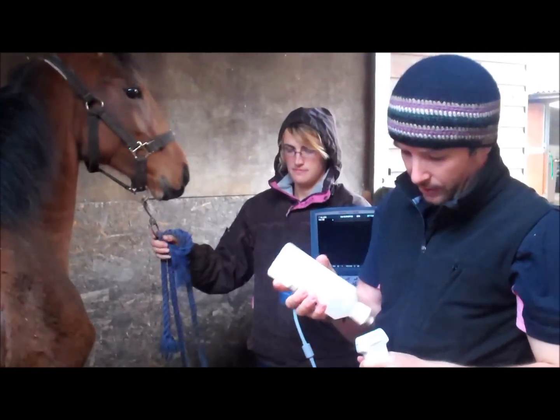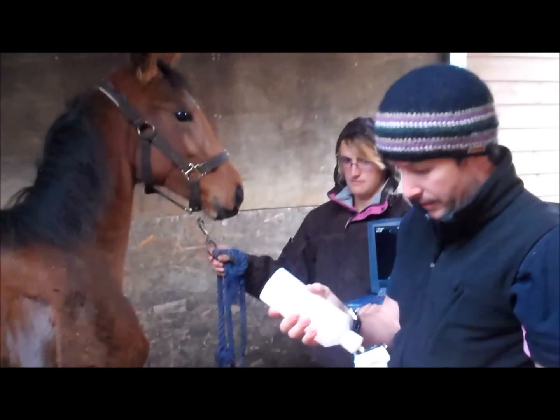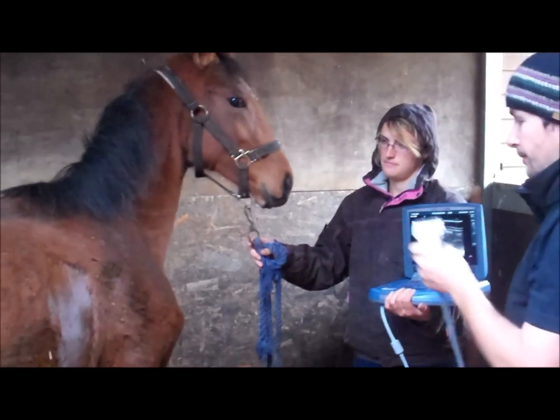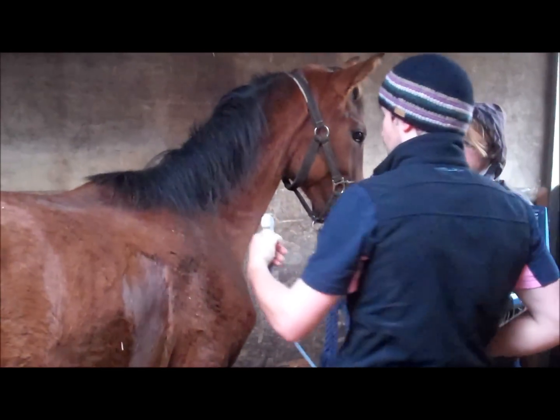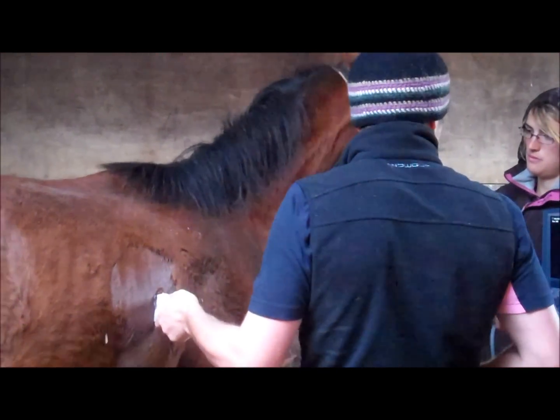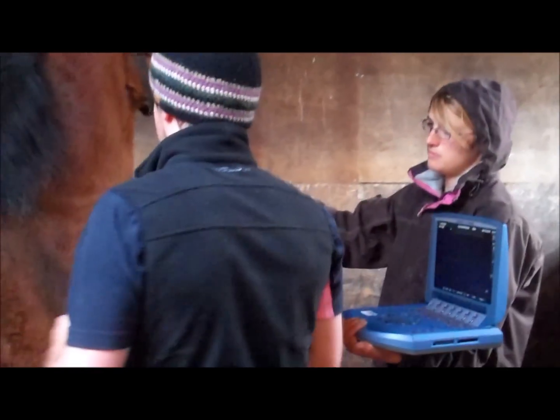We just want to take a quick look at this youngster's chest during a period of being off colour. We just want to check that we've got a good image. No signs of blood in your mouth. Good girl.